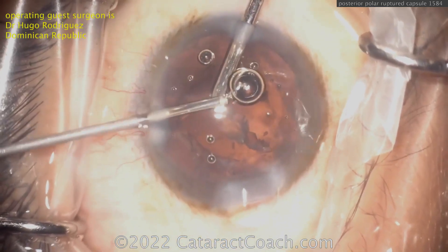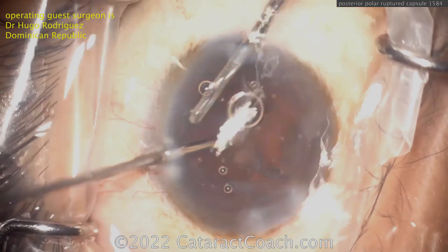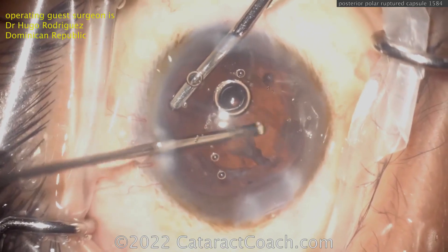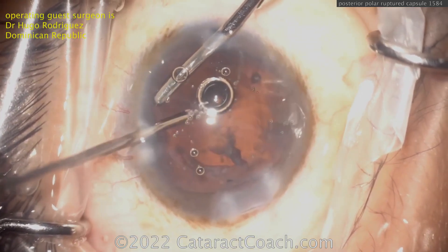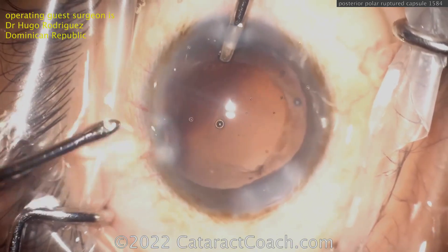Notice the bimanual approach through the side ports — very nice here, getting that anterior vitrectomy done. I find Triamcinolone helpful here to help stain and get a little more obvious delineation of the vitreous. And here at the end, nicely cleaned up.